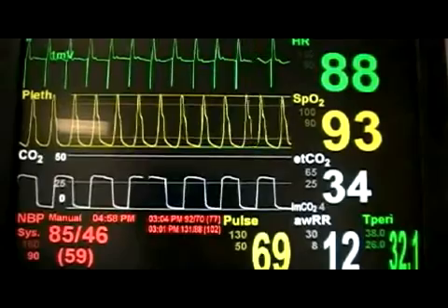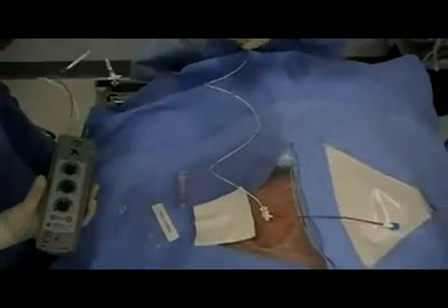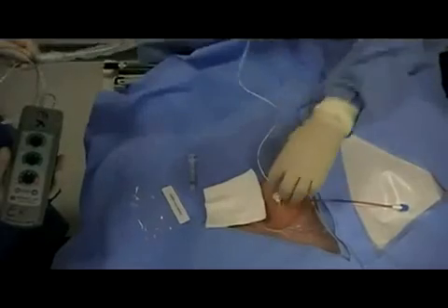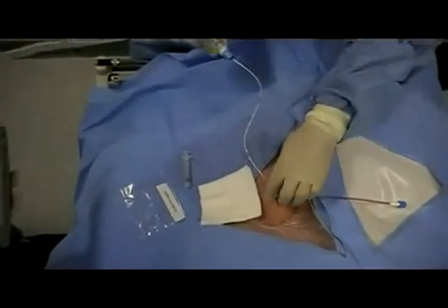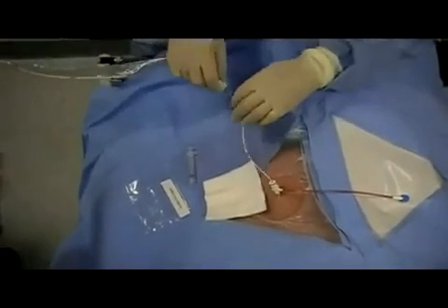Once capture is sustained on the monitor, the contamination shield can be connected to the cordis port and the cordis secured. It is important to remember that at any time an air embolism can be introduced through an unsecured catheter, and all precautions should be taken to prevent this occurrence.